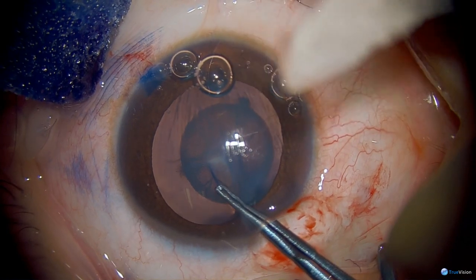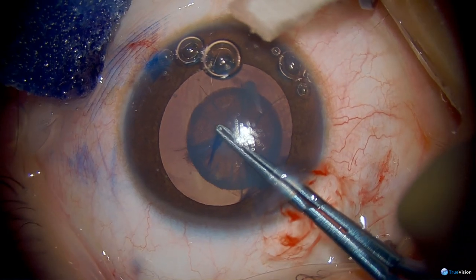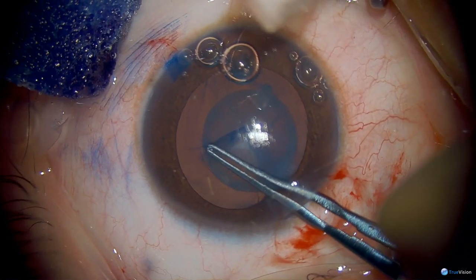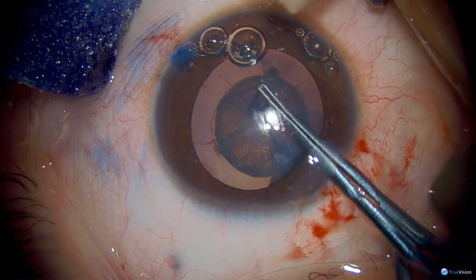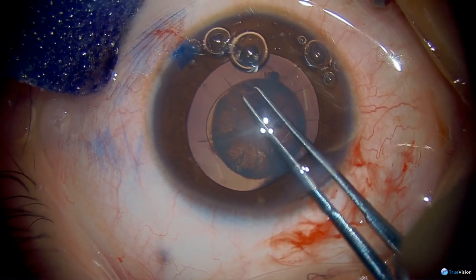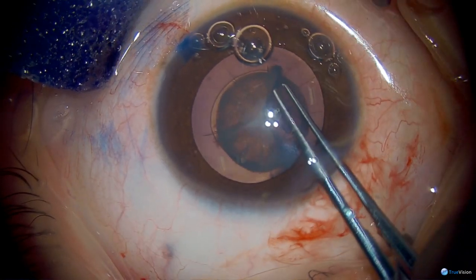You can see that while to some degree it's being led around tangentially like you do with an adult, you do have to be careful with pulling towards the middle a little bit more than you would normally with an adult. And again, to my point earlier about wanting to stain the capsule, you can see how that capsulotomy is almost identical to the nuclear opacity size. So the capsular staining is helpful in these cases.